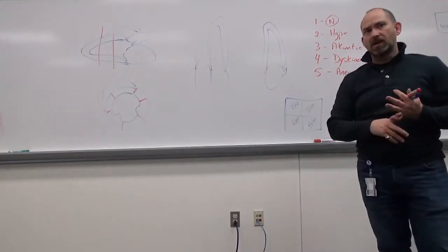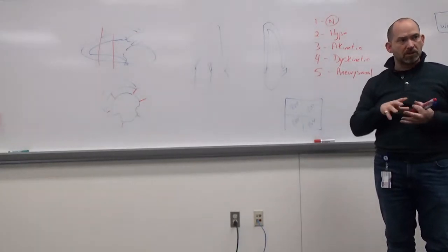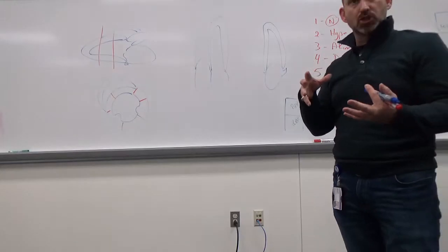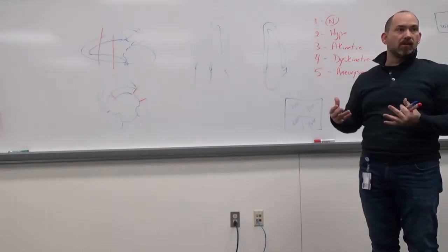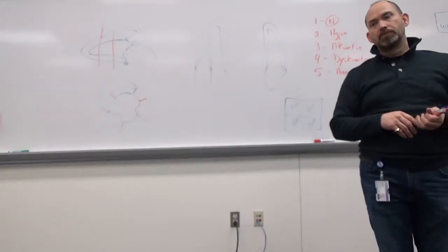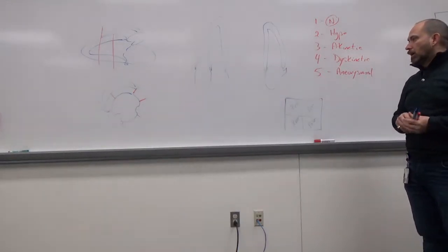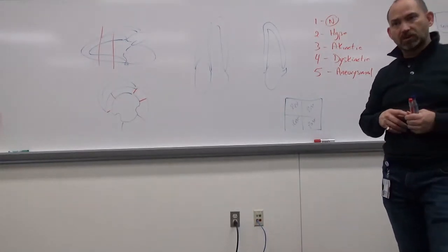I did mention in my slides that you are going to see a mild increase in volume in diastole because of the calf veins and the sinuses pushing that extra blood volume up into the heart, but that's very, very minor. But if we're seeing a significant dilation of the images both in diastole and systole, that's a sign that something bad is going on. We're getting a bigger backup of blood. It's not being ejected like it should. So physiologically, you normally get a slight amount of increase, but if you're getting a decent amount of increase, that's not a good sign. Okay? That usually means that something's not as efficient, and so then we're looking for a wall segment that's causing that.